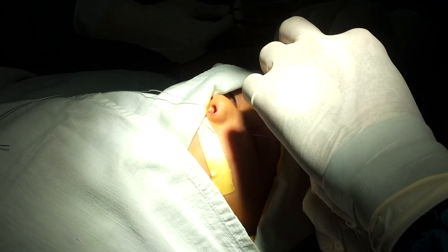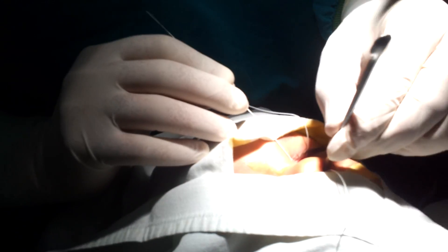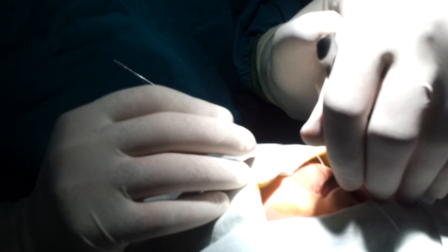Now we are in the nose, and this is our instrument again. We will do exactly the same thing — go lateral and downwards. You need to go down and lateral. This is not backwards and lateral — this is down, towards the palate. Down and lateral, not backwards and lateral.